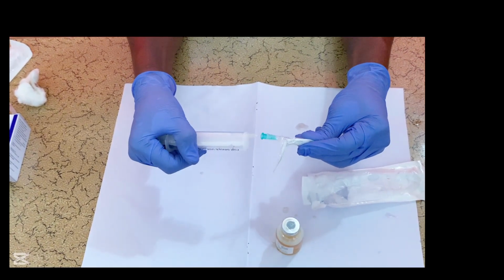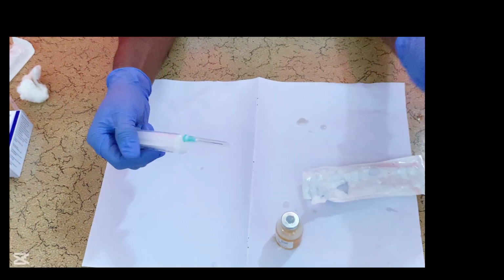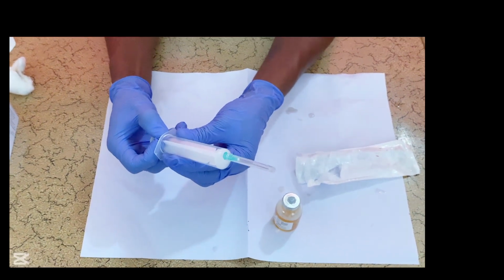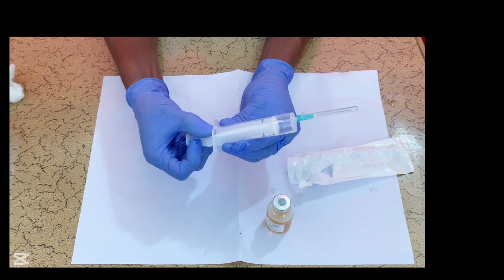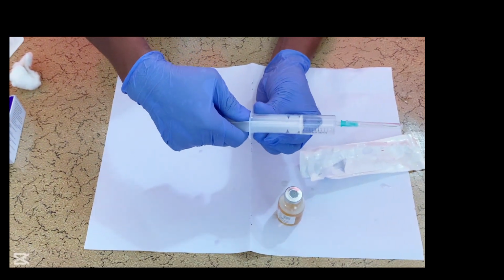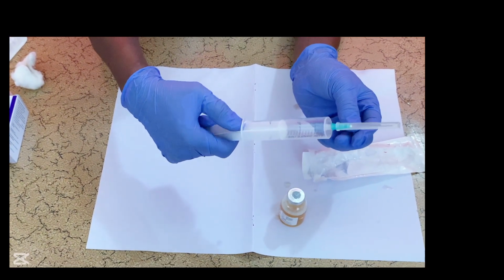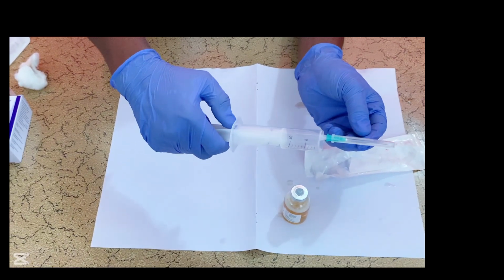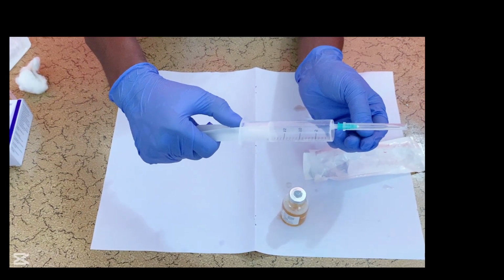You attach the needle to the syringe. Then, before you start withdrawing the drug, ensure that you put an equal amount of air bubbles into the vial.